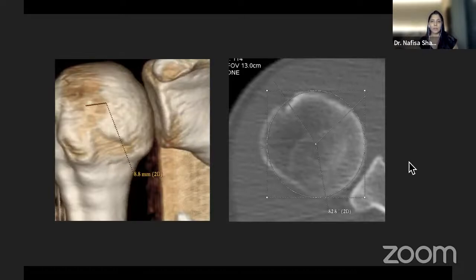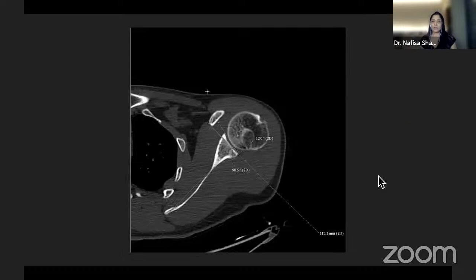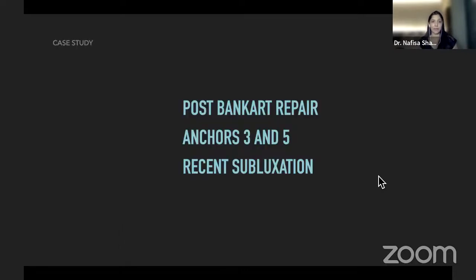What we do is calculate the corrected gamma angle, which is the gamma angle plus, for every 1 mm of glenoid defect, we add 2 degrees. So if the gamma angle is above 90 degrees, then that's an engaging reverse Hill-Sachs lesion. One can also easily calculate the degree of retroversion in this patient. And sometimes calculating the retroversion on the other side also helps.